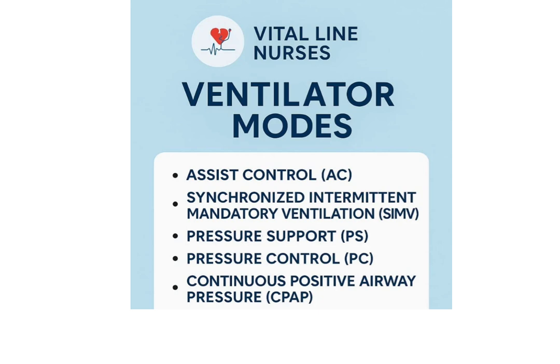4. PSV, pressure support ventilation. Lastly, we have PSV, or pressure support ventilation. In this mode, the patient initiates every breath, and the ventilator helps by reducing the effort needed to breathe in. It's commonly used during weaning.